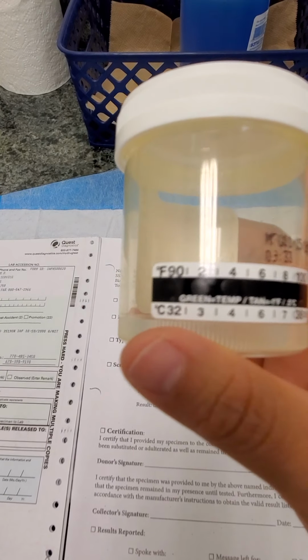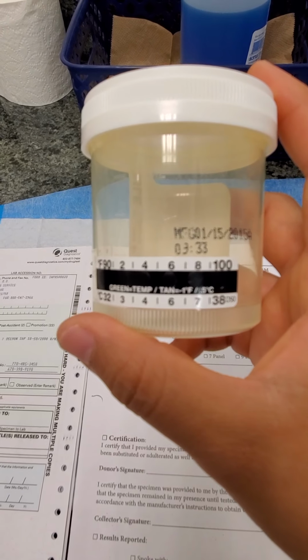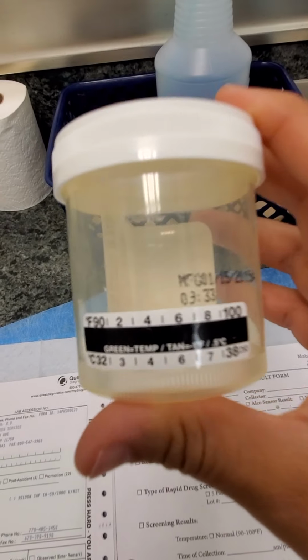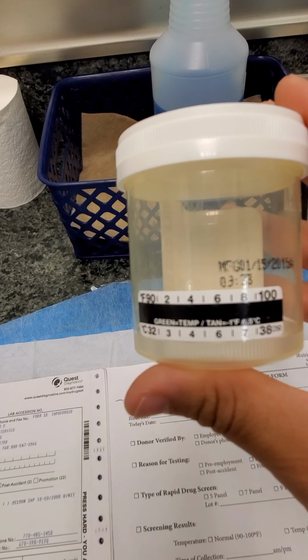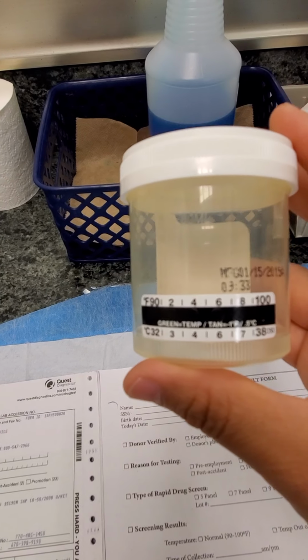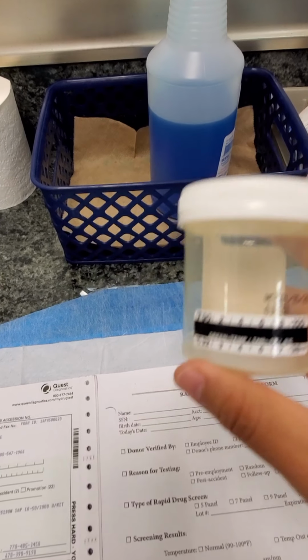If they come out with their cup and it looks just like this, either it is too hot or it has gotten cold, and you cannot take this specimen. You cannot accept this specimen. You would have to let the patient know that their specimen is not registering a temperature, and that you have to discard the specimen and recollect again.